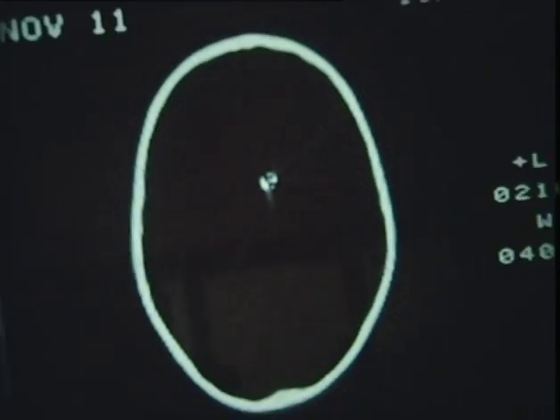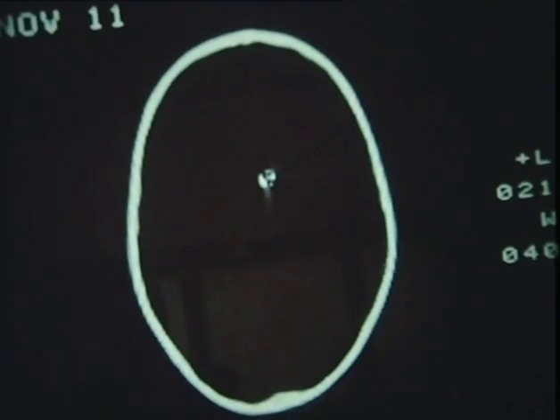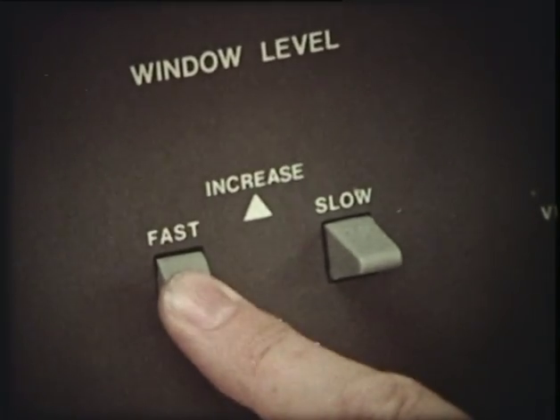We were able to see from the position of this bullet on the scan that, once again, this was not in a life-threatening position, and it was decided that it was better not to remove this bullet. We recently saw another patient who came into hospital complaining of pain in the head. It wasn't until after he'd been scanned that it became apparent that he too had a bullet in the head.